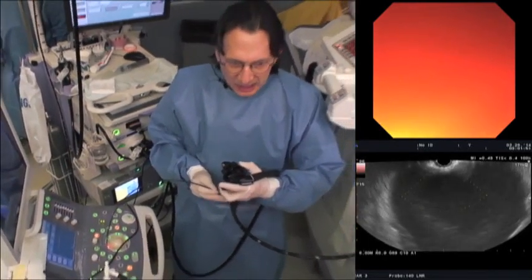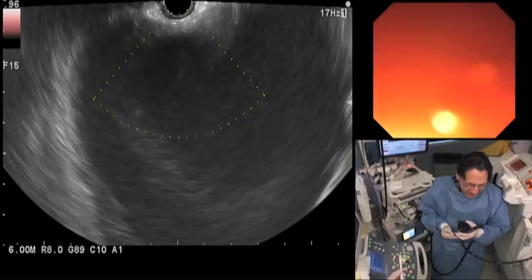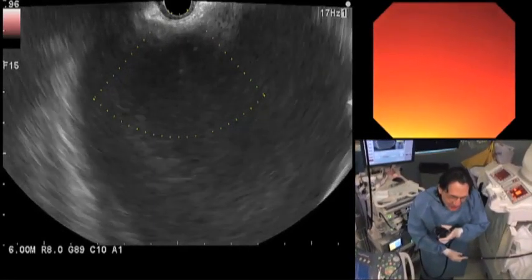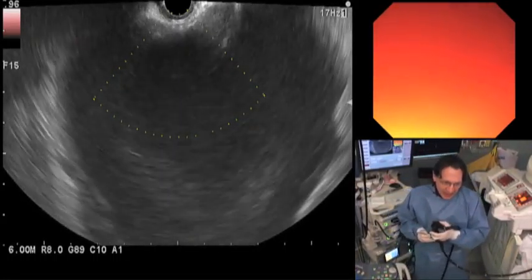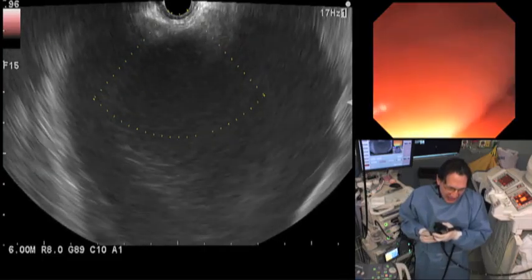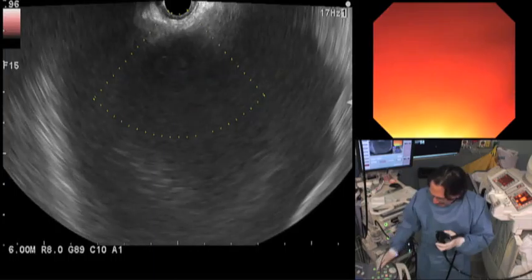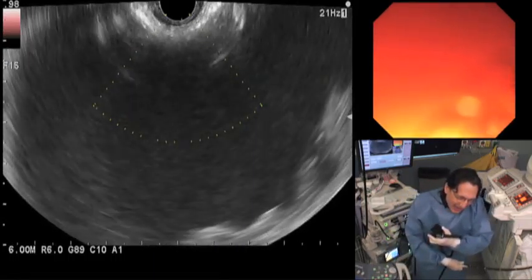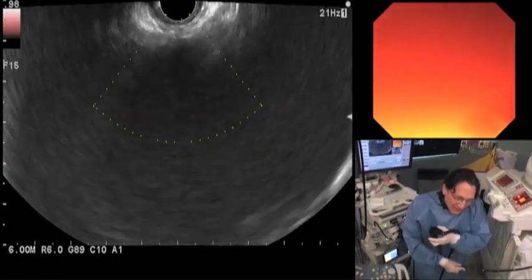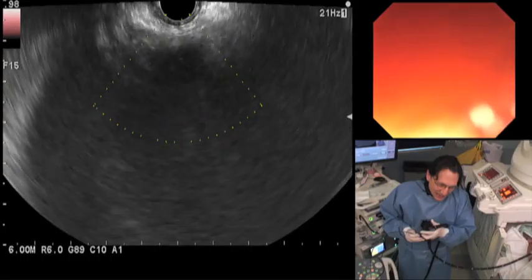So the first thing to do is to look for the tip of the needle knife. And this is the first drawback of this instrument, that sometimes it can be hard to see the tip of that Zimmer needle knife, and that's exactly the case right now. I'm having a little difficulty seeing that, and if you have an F&A needle, you can usually see it very well, very clear, and you may not see the Zimmer needle knife that well.